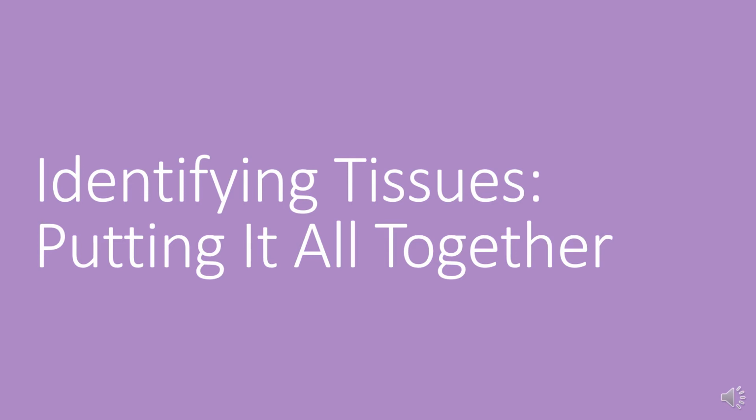Now that we've worked our way through how to name all of the different tissues, I want to take a moment to put the entire dichotomous key together in one place. We always start by finding cells. We typically do that by looking for the dark staining nucleus and then trying to find the light coloration of the plasma membrane that goes around that. Once we found cells, we ask, do those cells pack closely together?